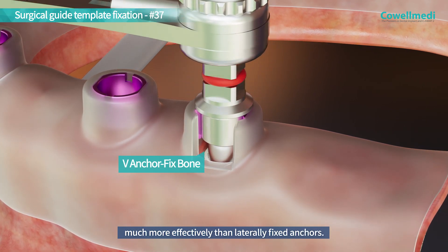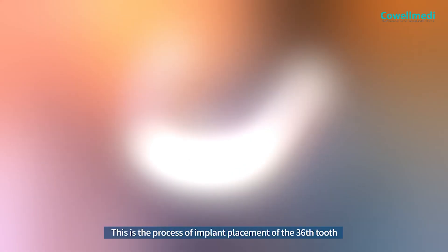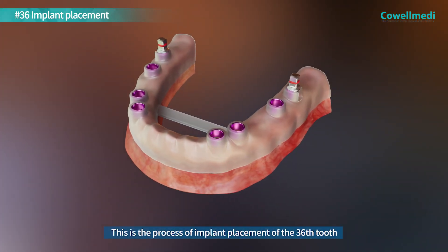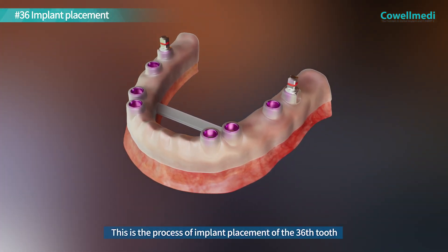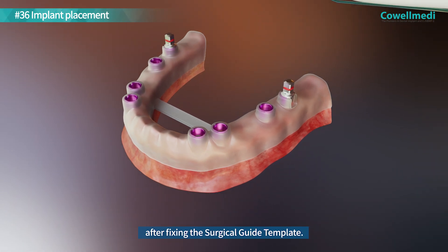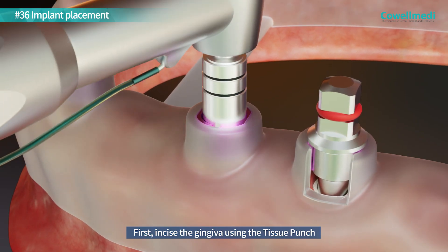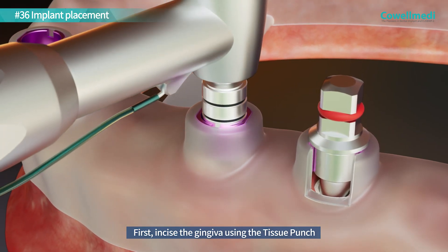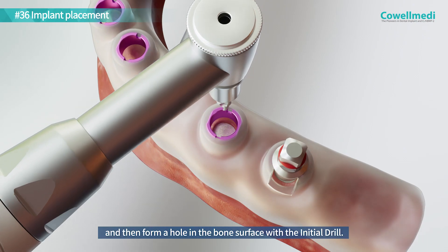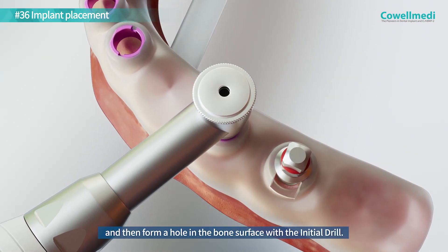This is the process of implant placement for the 36th tooth. After fixing the surgical guide template, first incise the gingiva using the tissue punch, and then form a hole in the bone surface with the initial drill.